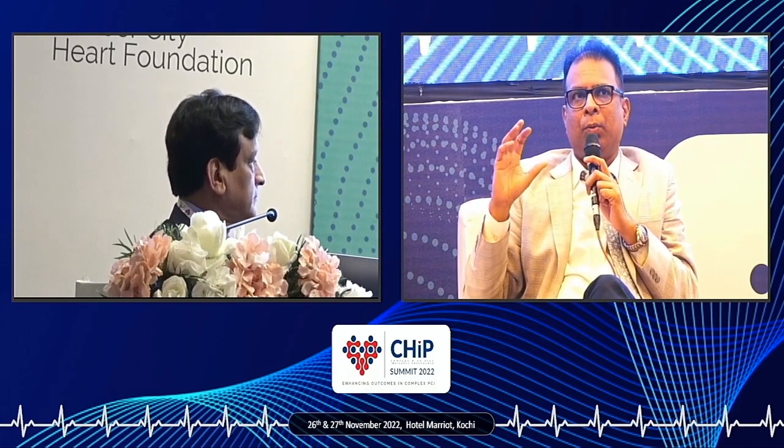And second, suppose you do the rota in a long LAD calcified, tram track calcification, severe calcification. You do the OCT now, and you demonstrate there are not many dissections. You can just put a proximal stent. Your proximal stent was a little underexpanded. You put all your energy, all shocks, all rota efforts in the proximal LAD. The rest of the LAD can be managed by DEB. Is it a far-fetched thought, or is it a possibility?